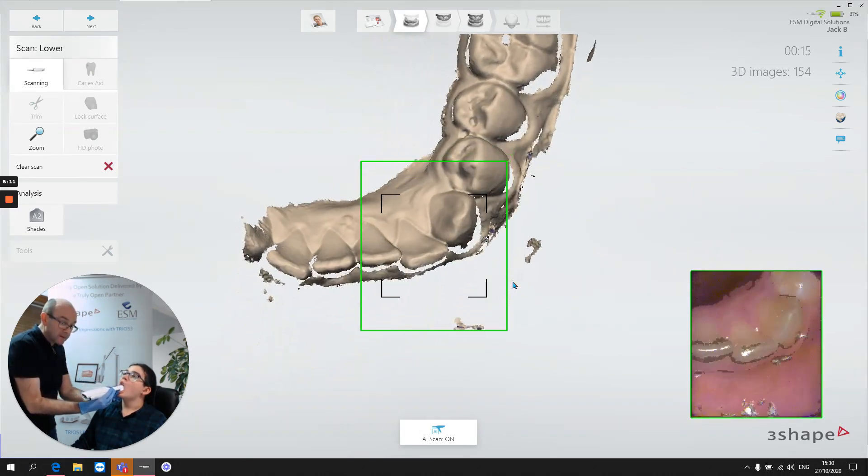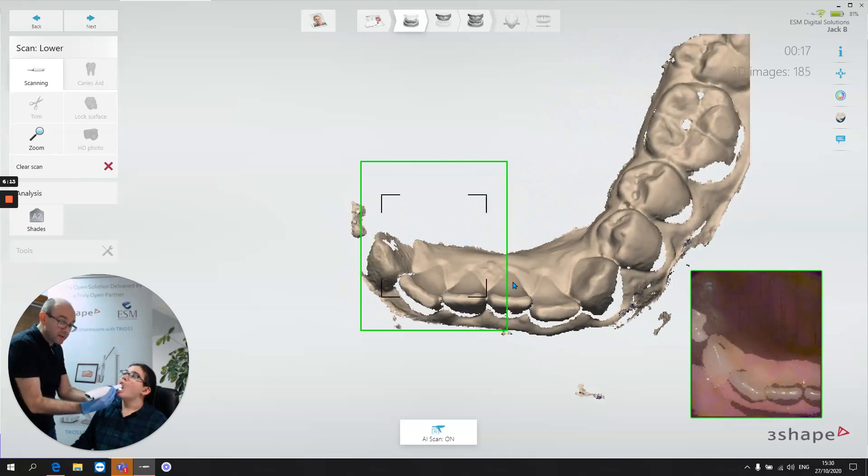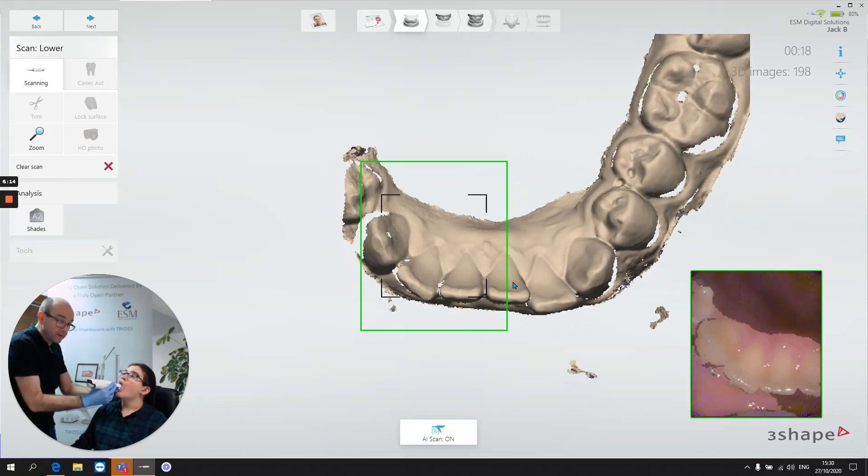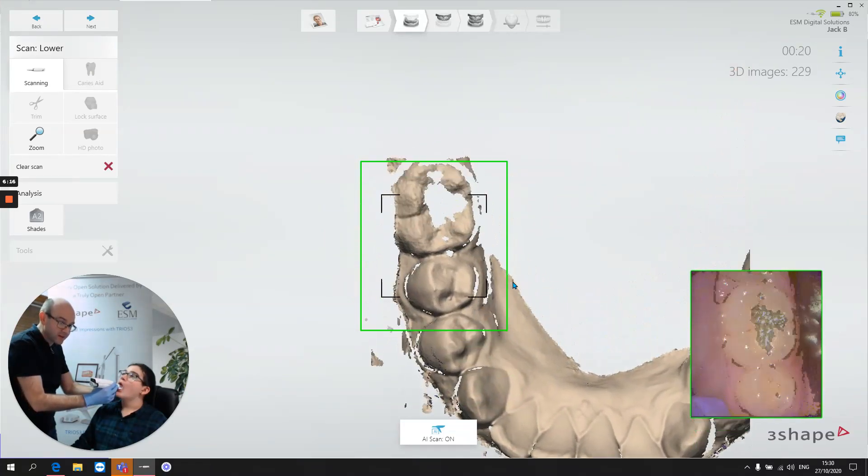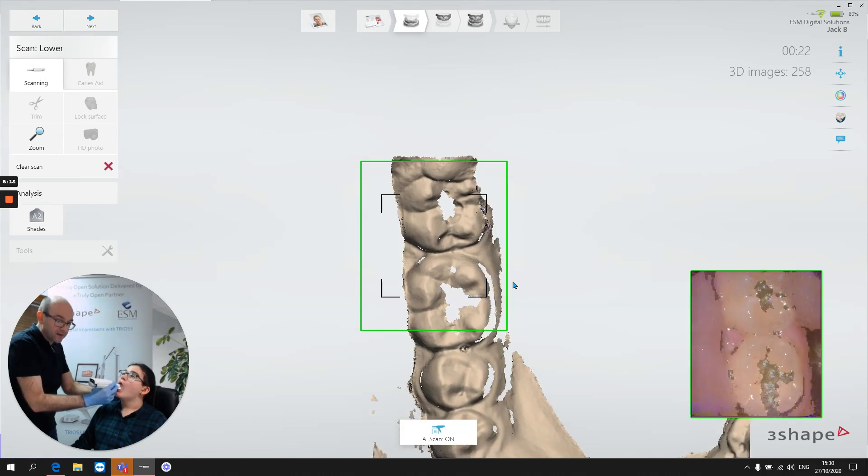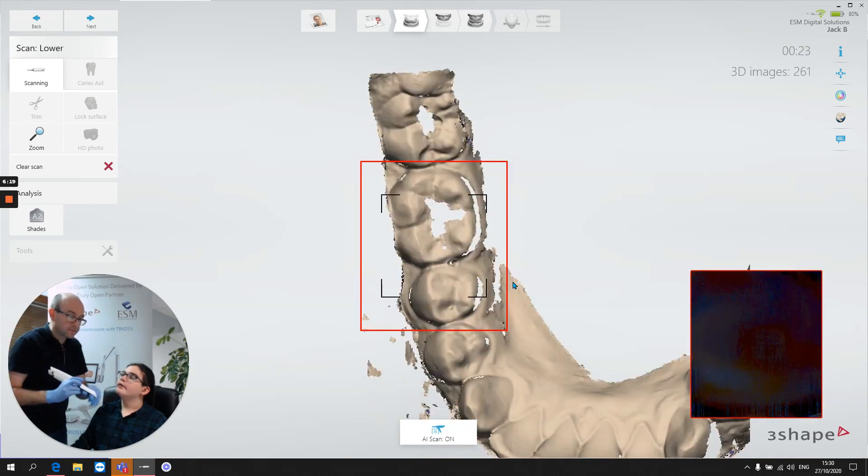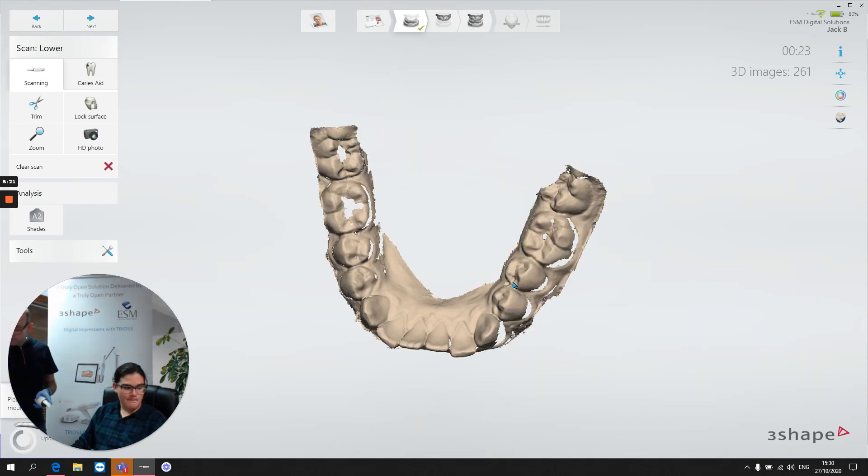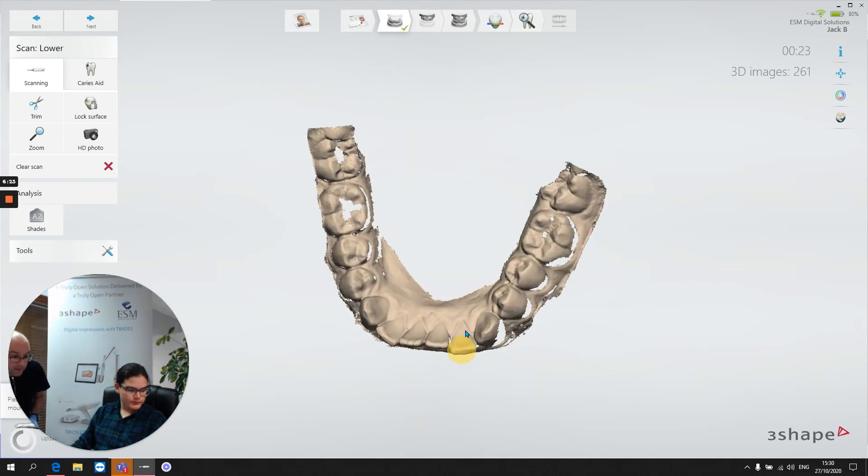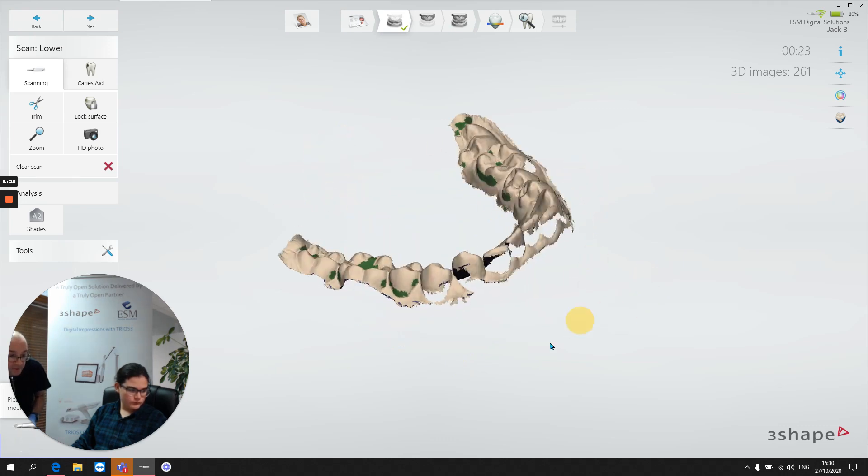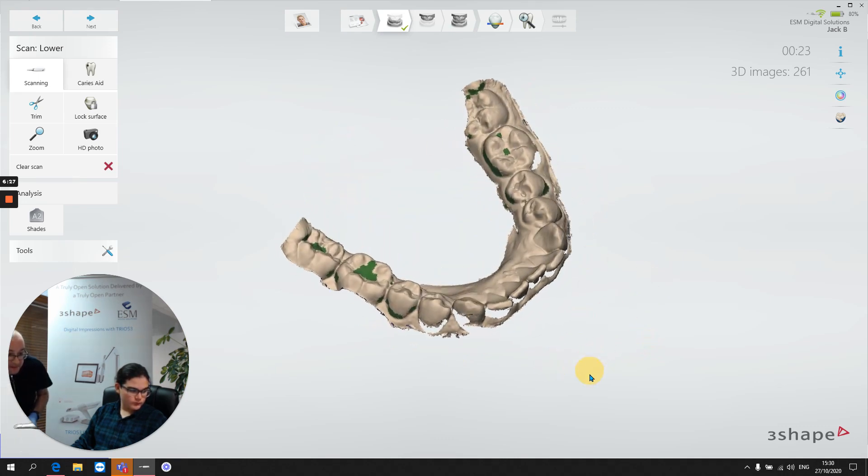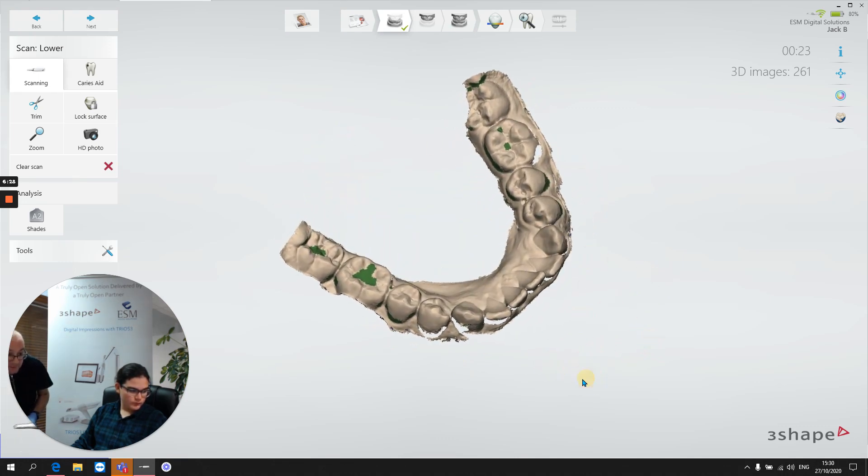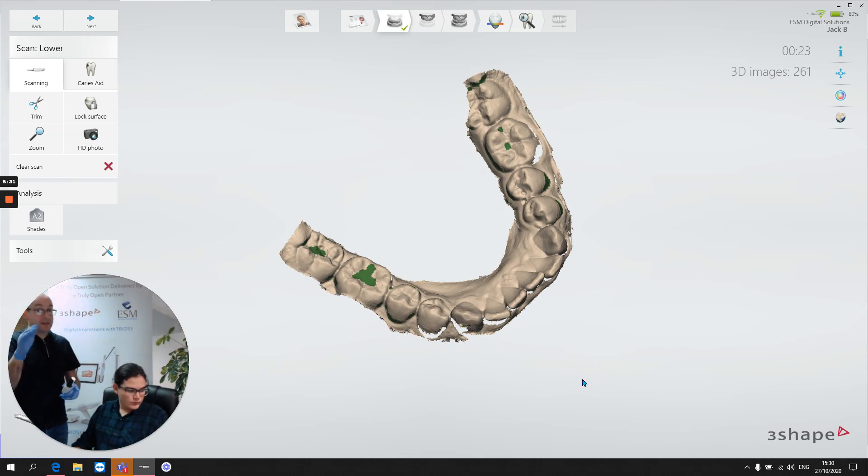Let's get back to where we were. Rock the scanner a little bit just to capture a little bit of lingual and a little bit of buccal information. And then you can see we've captured a nice level of detail. So let's complete this scan. We've got occlusal detail, got a nice level of lingual detail, and a nice level of buccal information as well.